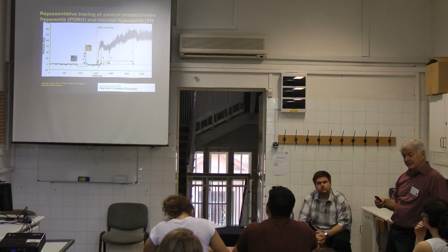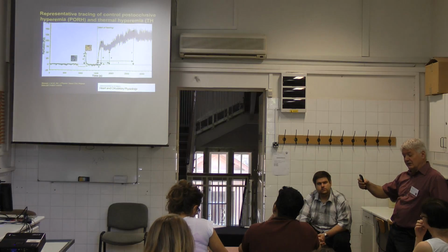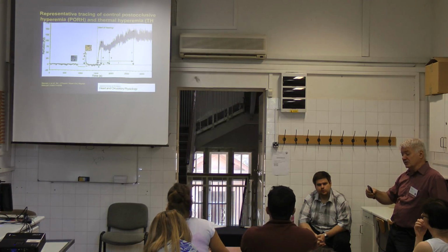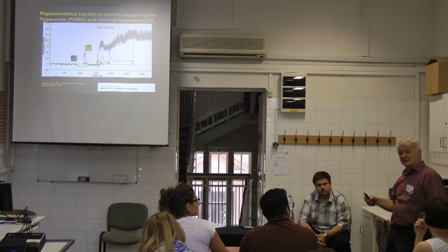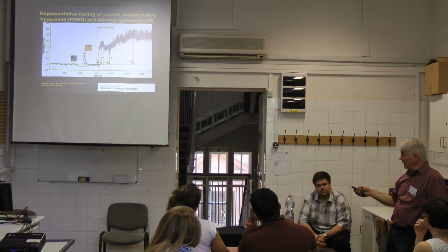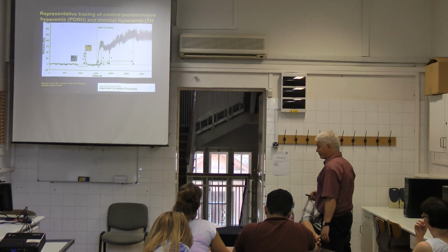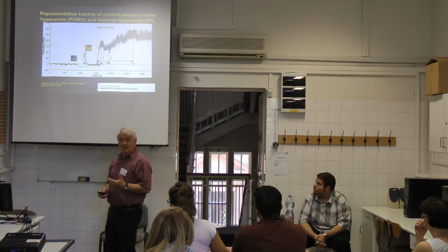As it turned out, this spectral analysis is reflecting the nature of the vascular smooth muscle cells, the nature of the innervation. The peripheral vessels are innervated mainly by sympathetic fibers. The loss of the sympathetic tone is resulting in more and more fluctuation. So therefore, for an educated expert, this type of recording is conveying a lot of information.